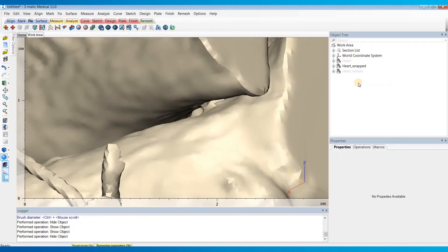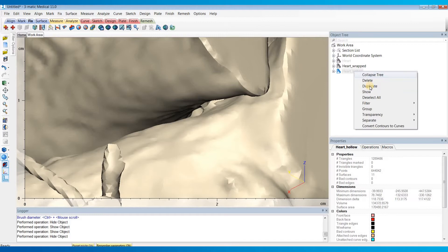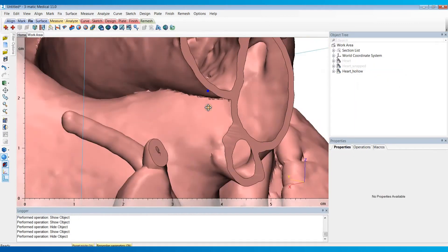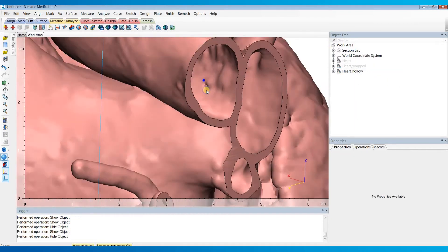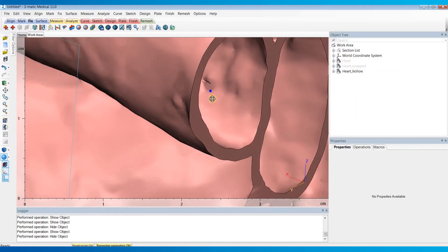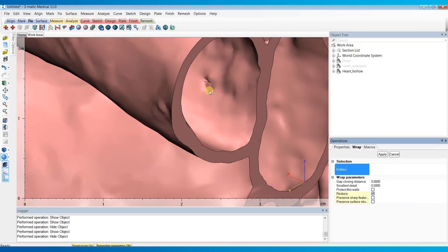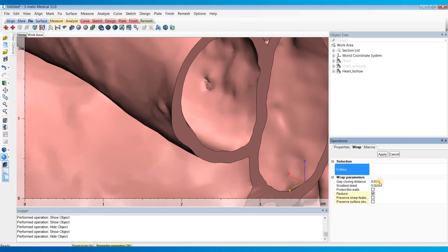That connection caused the hole that you see in the hollow model to then exist right here. Now when I did the wrap operation, I even had the gap closing distance set to zero. But it's just the fact that those two vessels were so close that the distance between these vessels was likely smaller than the detail level that I chose.